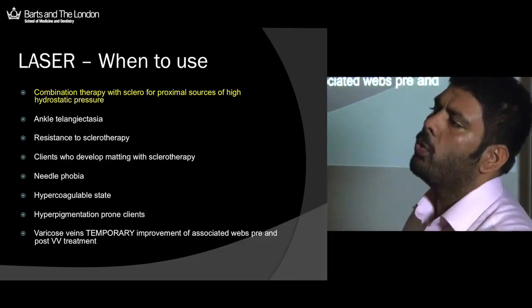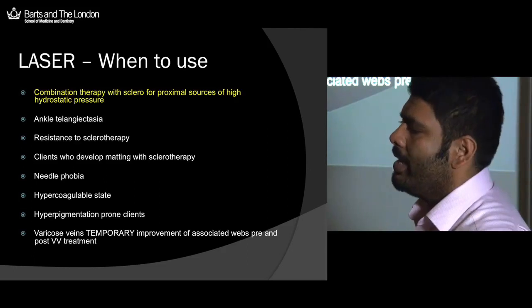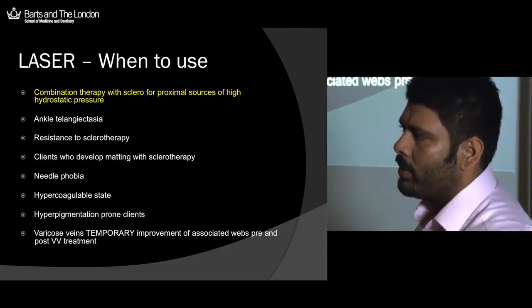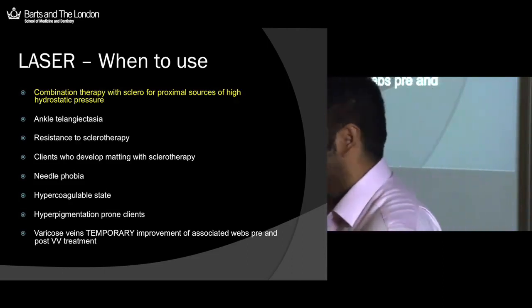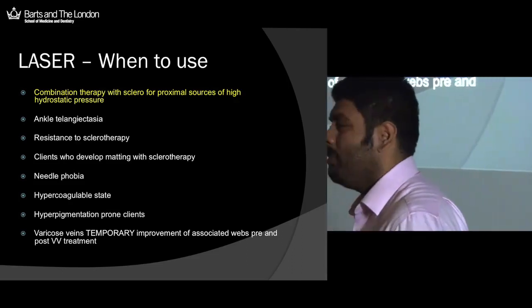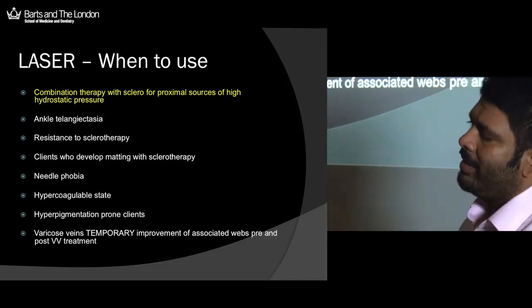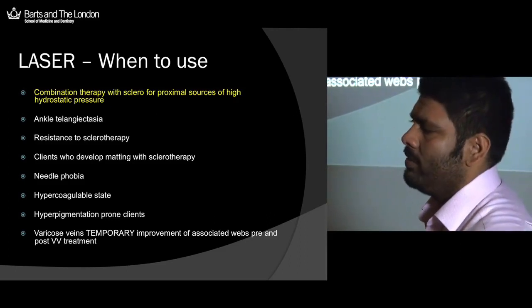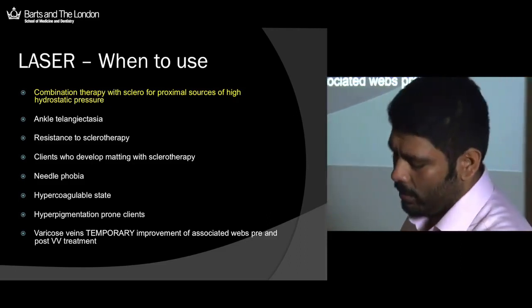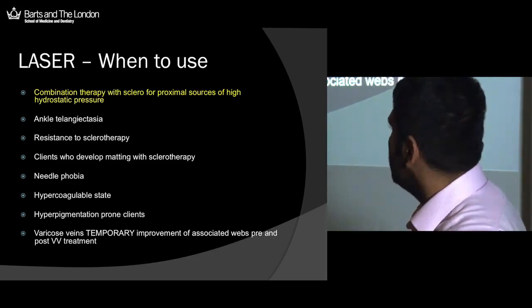They're actually quite a poor choice for leg vein treatment, and that is why inevitably I'll get so many people coming to say, well, they tried a little bit of IPL, they tried a bit of laser, it didn't do anything, and actually it just probably made them look a little bit worse. So please, please, please think about what you're doing with lasers. Don't just choose conventional vascular lasers and say PDL works on the face, so it must work on the leg. That is not an obvious deduction, and I'll explain why in just a second.